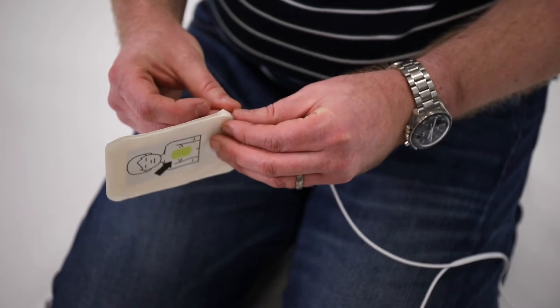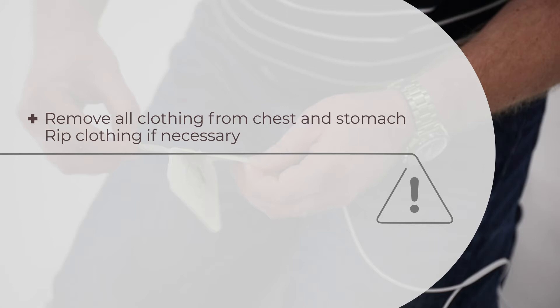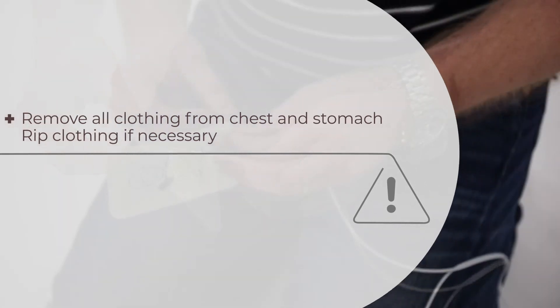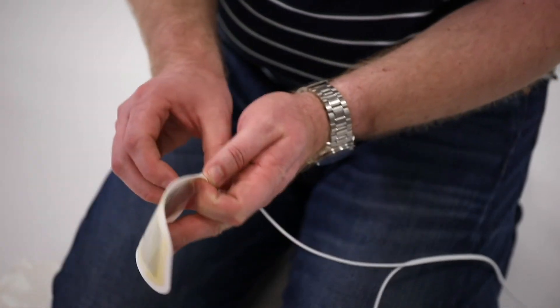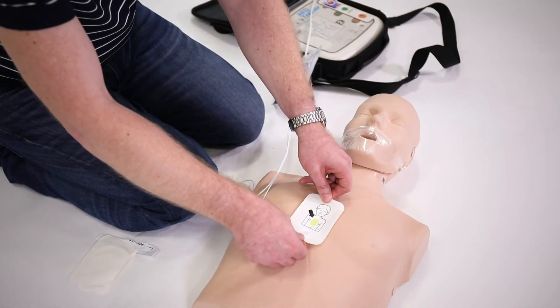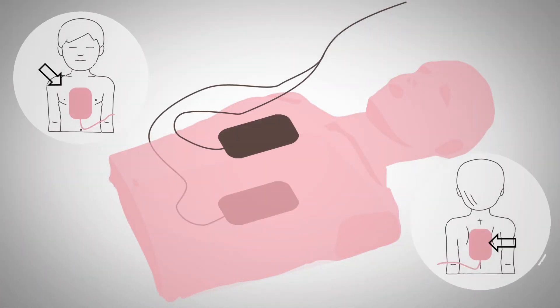Remove the backing paper from one pad. Remove all clothing from chest and stomach — rip clothing if necessary. The first pad should be pressed firmly onto bare skin in the centre of their chest, about level with their nipples, and the other pad is placed in the centre of their upper back. The pads should be positioned lengthways, with the long sides in line with the length of the child's body.